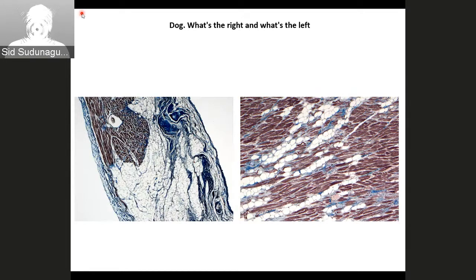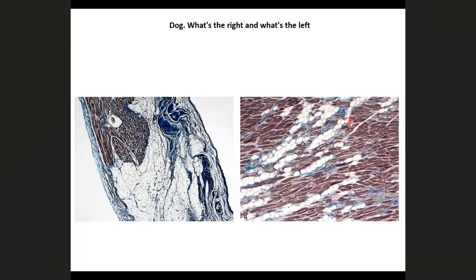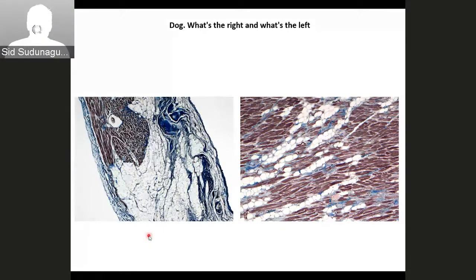So I think the myocardium, the myocardial tissue, its arrangement is interrupted by the fibrous and the fatty tissue. I'm sorry, are you speaking about the left or the right picture? Oh, sorry, I should have specified. The right, it's more clear.